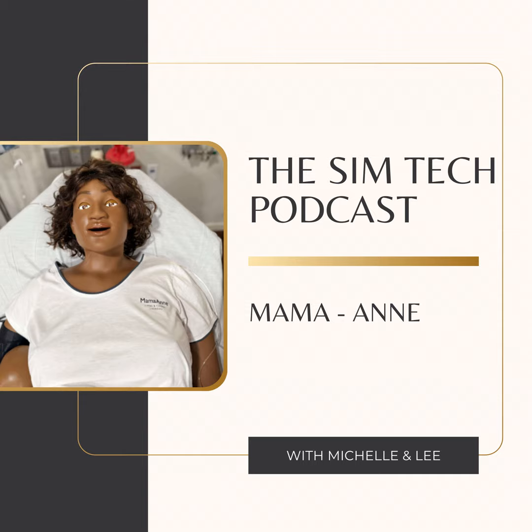As she's giving birth, I'm just going to talk through some of the airway features as well. So she does have a few more features that you can use on her from an airway management perspective. So she has got tongue swelling, so you can automatically put tongue swelling on as well.